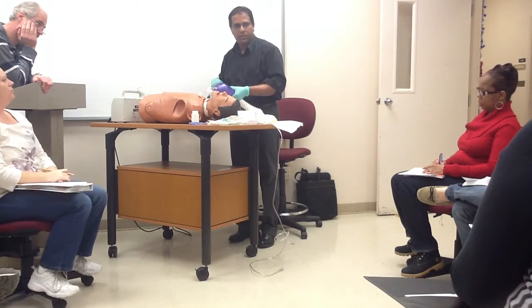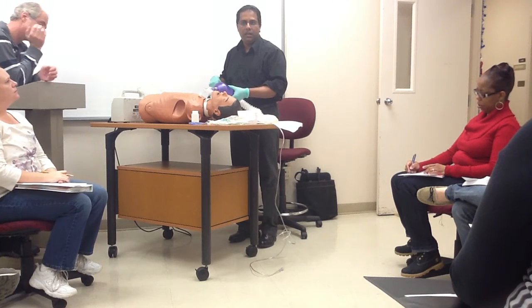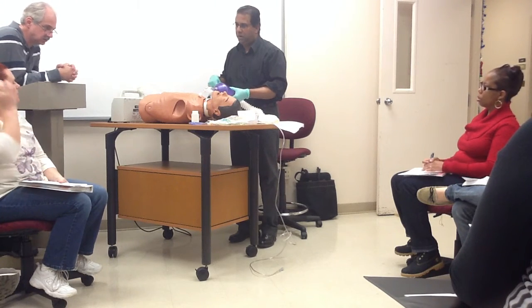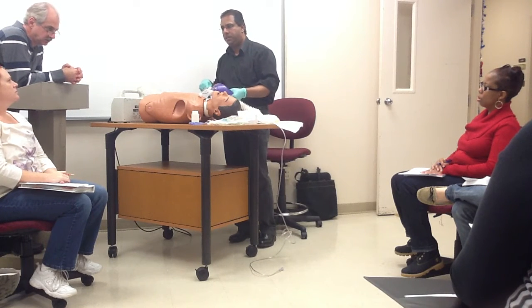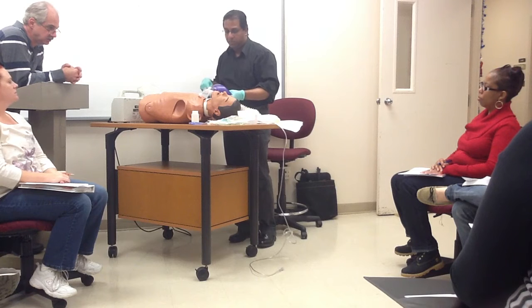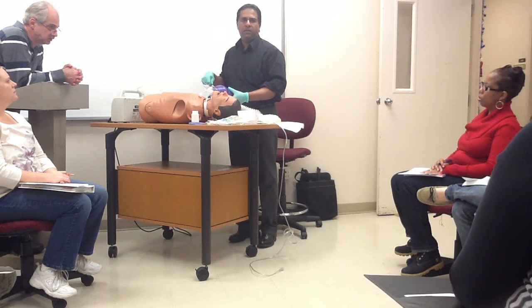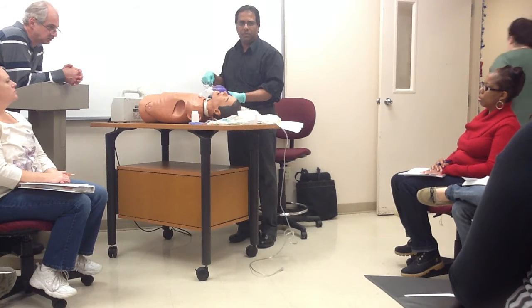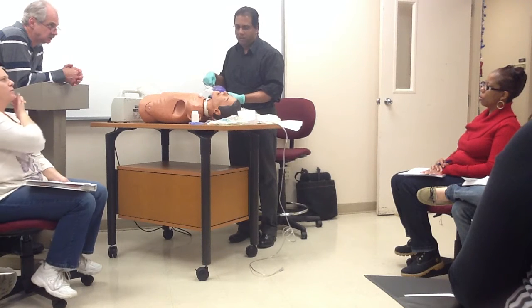How long? Okay. At this point, what am I looking at? I'm looking at the monitor for the heart rate, respiratory rate, and the saturation, and looking at the patient too. And let's say when you're bagging, the patient is coughing against your breath, continuously coughing while you are breathing. What are you going to do? You just have to go with their breath.